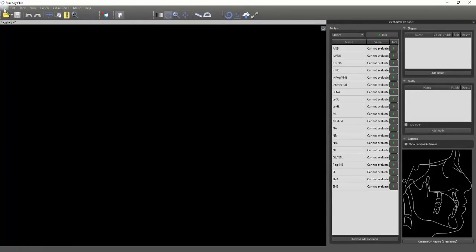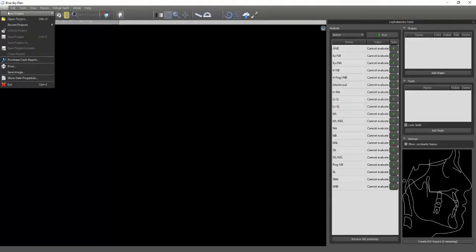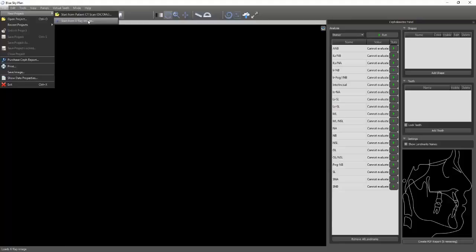It's because you just don't need as much. So we're going to come up here, go to File > New Project, and you'll see that there's Start from Patient Scan DICOM or from X-ray Image. So if you don't have a ceph but you have a cone beam, as most of you will have access to if you're using the software, you can do that.